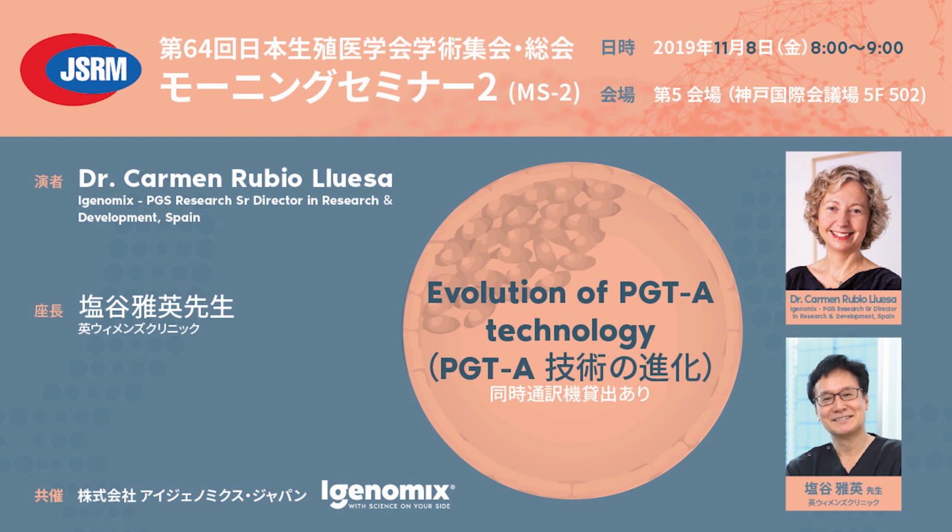But even though, we are proposing maybe a strategy to have not day 6 embryos, but day 5.5 embryos. So if you are worried about waiting one more day in culture for the embryos, you can schedule the oocyte retrievals, the pickups, as late in the day as possible, and do the ICSIs or the IVF cycles the latest of the day, maybe in the afternoon. So if you do the last ICSIs of the day, the last IVF inseminations, then if you collect the media early on day 6, the age of the embryos is only day 5.5. It's not exactly day 6.